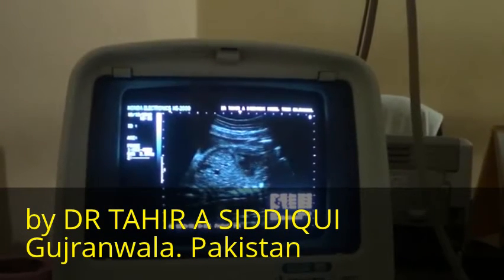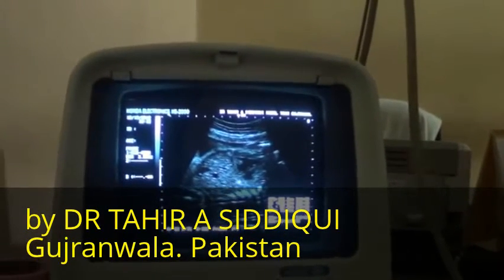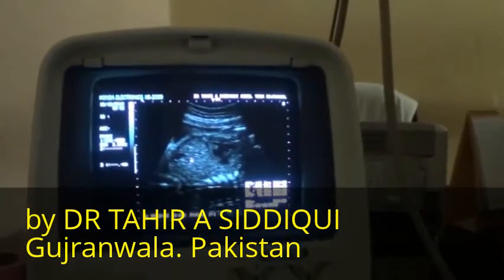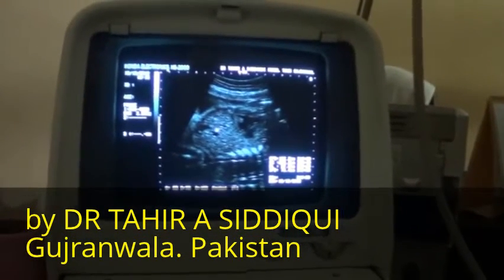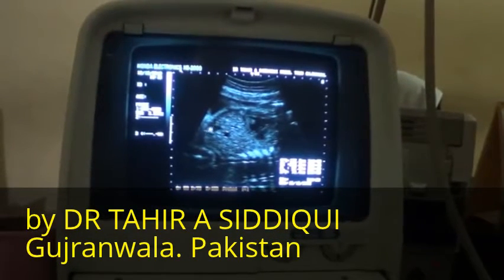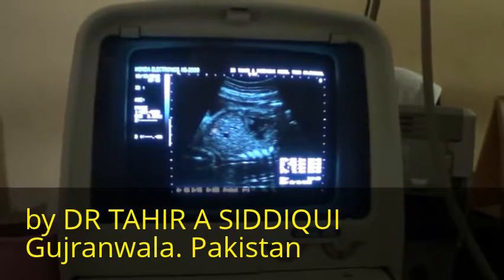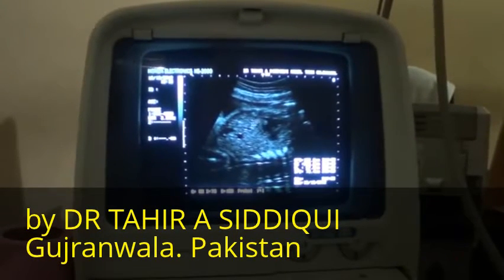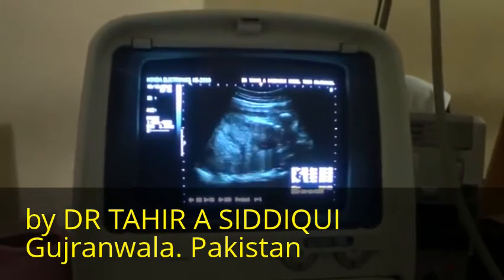Now you can clearly see that this is the diaphragm, this is the liver, this is the gallbladder, this is the portal vein radicle. With the margins you can see an echogenic area. So this is the liver with portal vein radicle, however this can be a CBD or a portal vein. This is the heart, this is the diaphragm, the lungs. So the chest is seen normal.